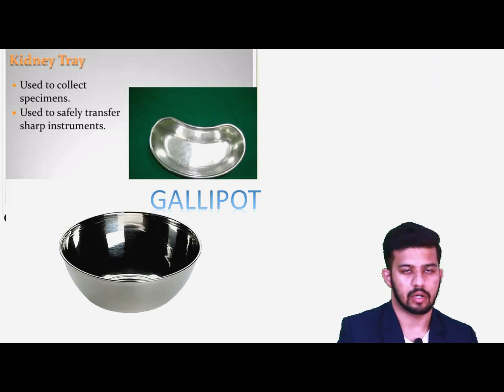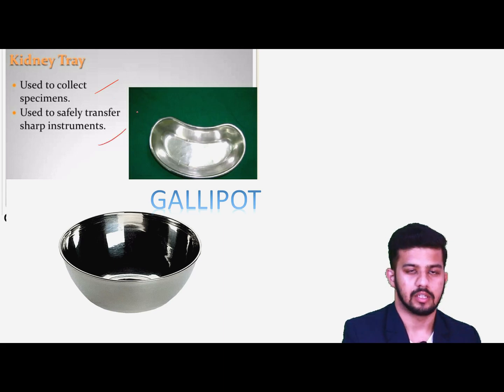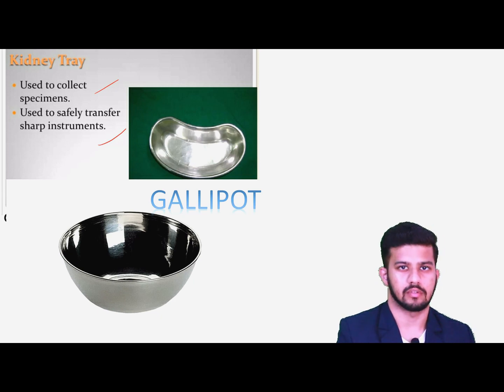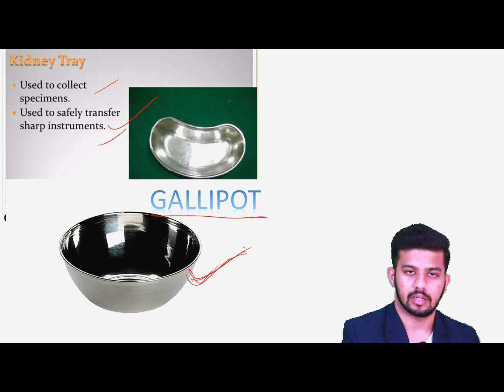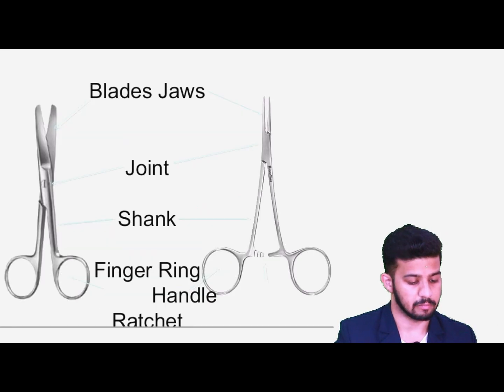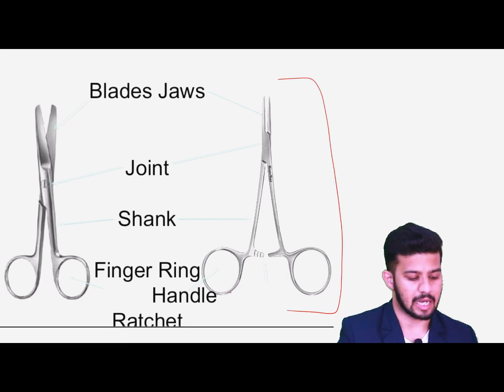We also have the gallipot, which we use for putting the sterile Betadine solution before painting. Now going through the basic parts of all instruments: we have the finger rings where we place the fingers, then we have the ratchet — the lock part is also known as the ratchet. Then we have the shank, the shaft part, the joint — this is the box joint or the screw joint — and then we have the blades or jaws.